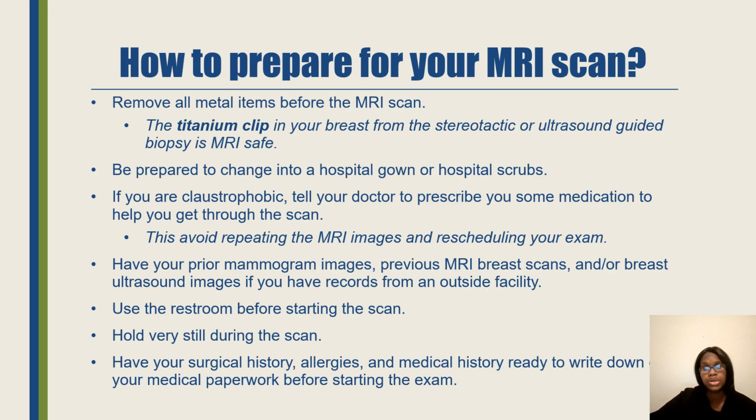To prepare for your MRI, tell the technologist before you even go inside the room if you have allergies to contrast, if you have a pacemaker or stimulator, or if you're claustrophobic. We have to know all of this because I perform MRIs as well. I'm also an MRI technologist and I perform breast MRIs every time I work in MRI.